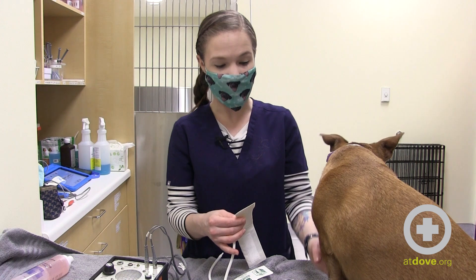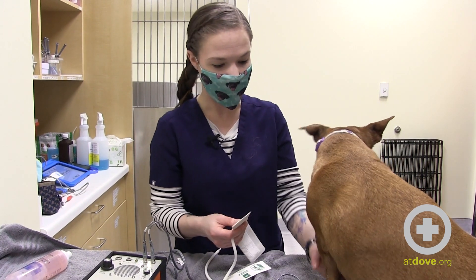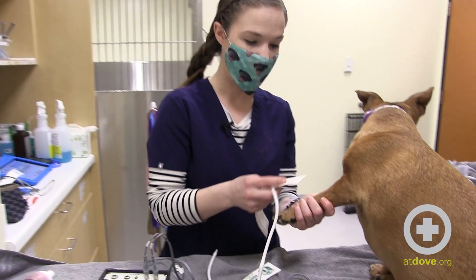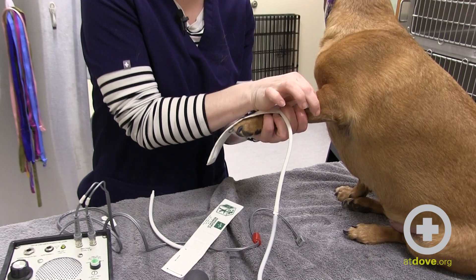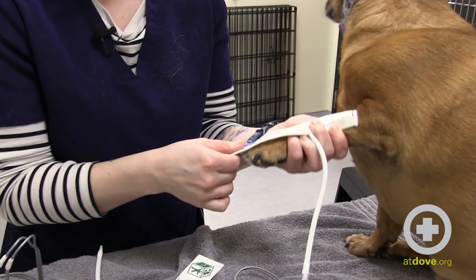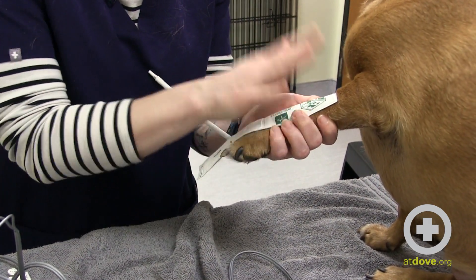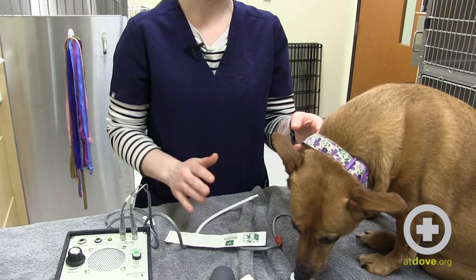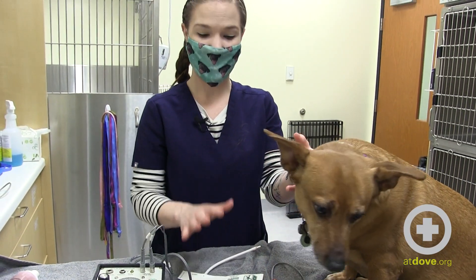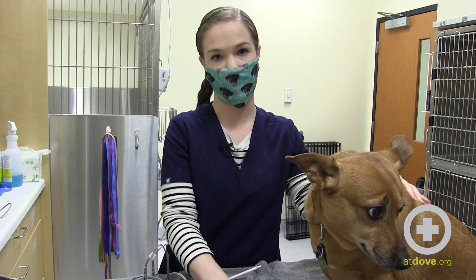So we want to make sure we're choosing the correct cuff size. For dogs, the cuff size needs to be 40% of the circumference of the limb you're using, and for cats, 30%. That's really easy to measure — you'll just take the limb and place the cuff vertically on her arm and wrap it around. Ideally you want it to be almost 40 to 50% around — that's the perfect size. A size 3 would be too small; it doesn't quite go all the way around, so it would be an inappropriate size for her and would actually give me a falsely elevated reading. If I took her blood pressure and got a really high reading, I can try a larger cuff. If the larger cuff is still giving me a high blood pressure, then that means it's probably true for this dog.